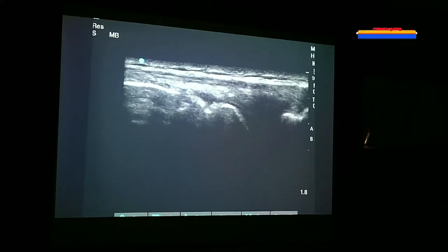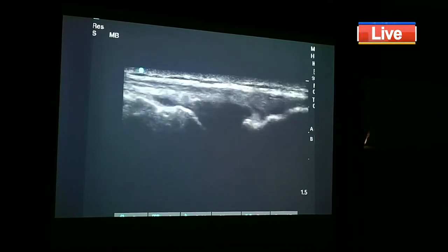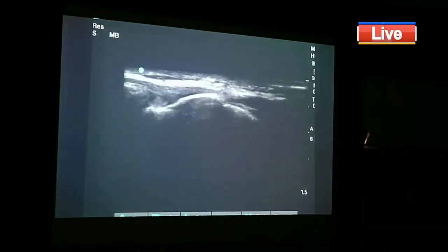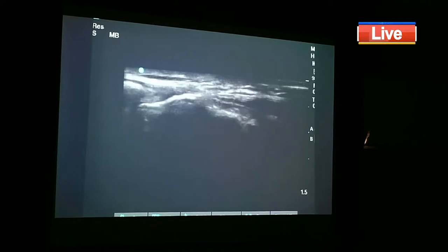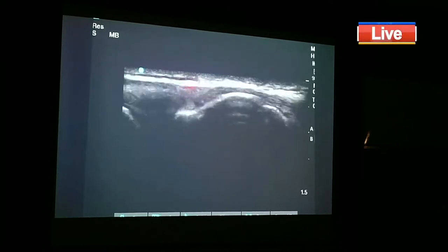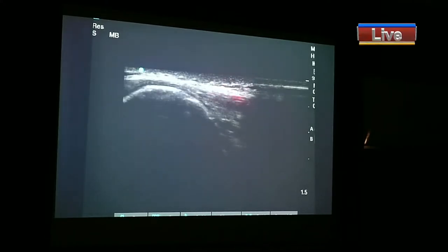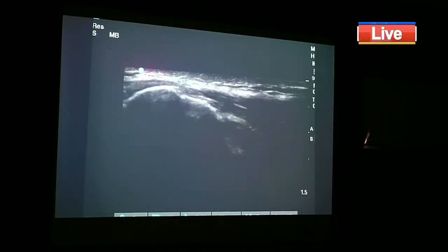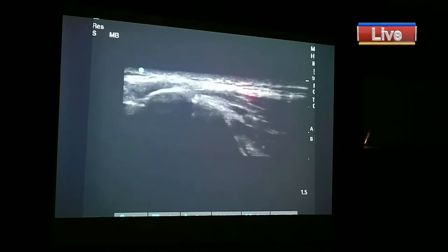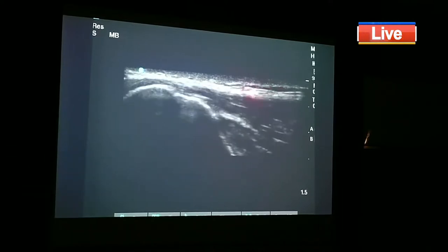The structure went away. So now you see there are also structures. This middle one was the meniscus, and this is now the tibia. I'm going to the tibia now, and just going down. You see this white glistening structure also coming and following me, and it will now get inserted here in the tibia. And as I go down, can you see this structure is going and continuing? Okay. And just let me show you where it inserts. I am going to turn slightly. So this is the tibial condyle. See the bone.